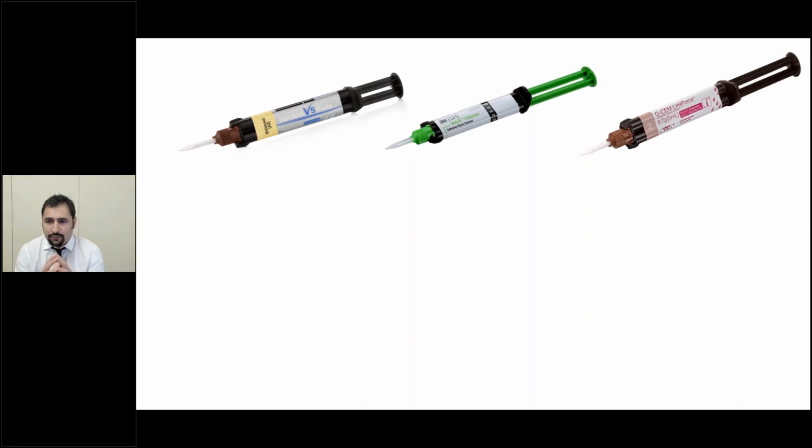So all these three cements are self-etch cements. What does that mean? It means that the components they have enable the clinician to not need etching the restoration or the tooth separately. In other words, there is a chance that I can just use these products without etching the tooth prior to bonding and get a good bond.